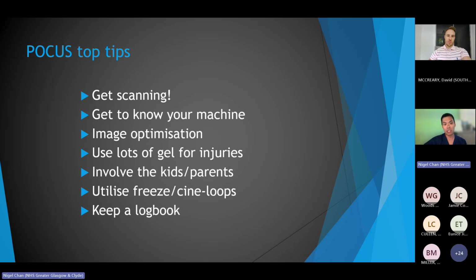As I touched on in the beginning, every time you're going to do a scan, think, why am I doing it? What's the question I'm trying to answer? Don't just scan something for the sake of it, because you might find something that you don't know what it is. That happens anyway, but as long as you recognize your own limitations as to what you can do.